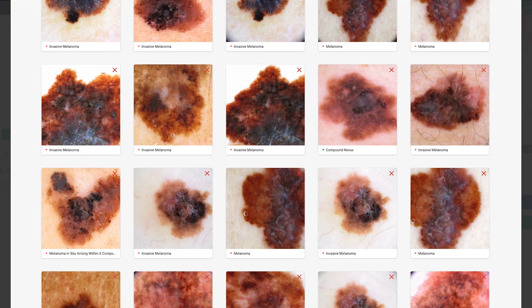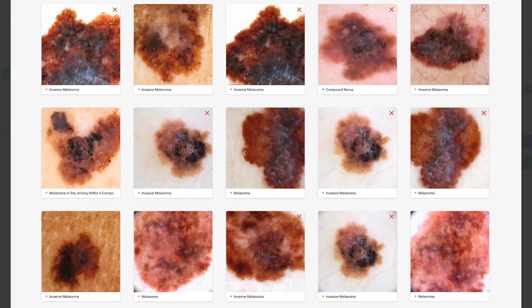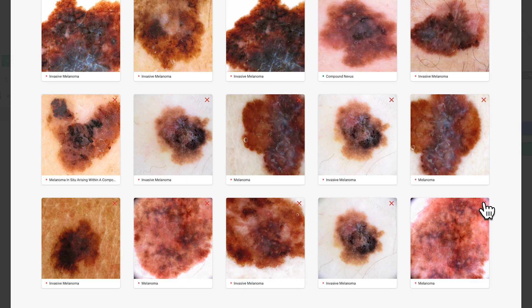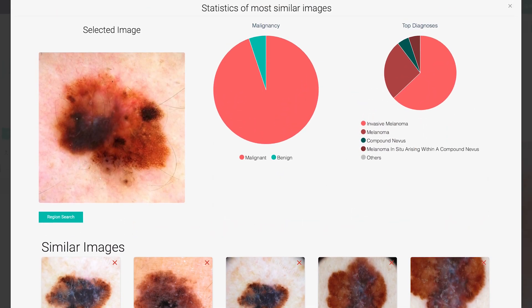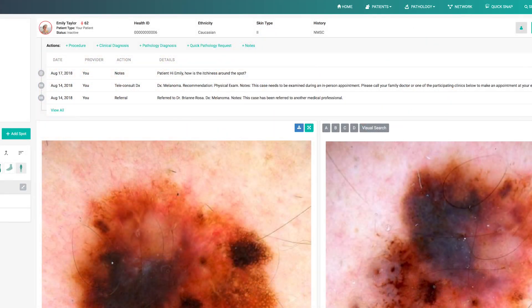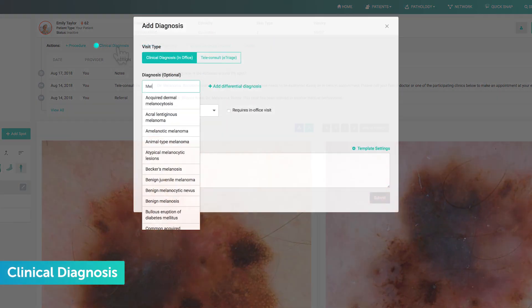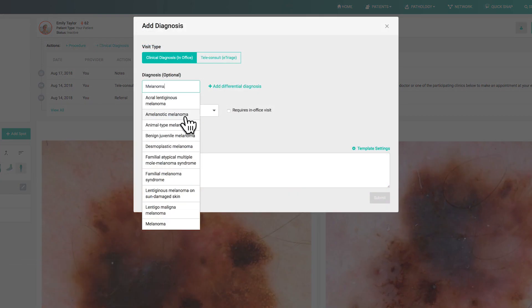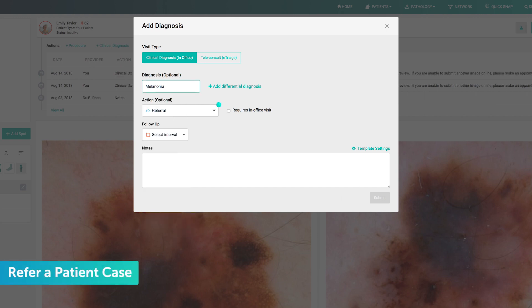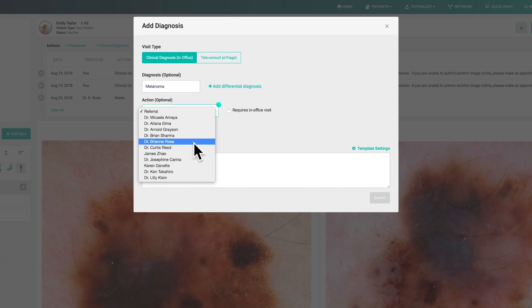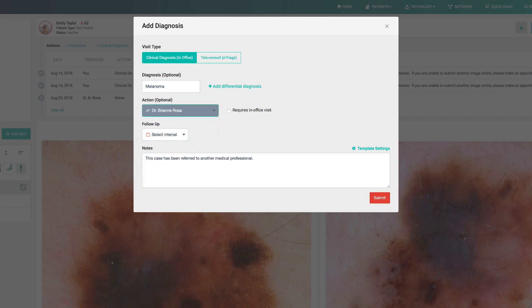based on statistics of similar images — it is not a malignancy probability of the query image. If you see a listed image that doesn't appear similar to your case, you have the option of removing it from the list to help improve the accuracy of the provided statistics. Now that we've analyzed this patient's spot, it's time to document it by adding a clinical diagnosis. Click the Clinical Diagnosis button in the action bar along the top. A pop-up will appear allowing you to fill in your diagnosis with a wide variety of options. Next, you have the option of referring the case to a colleague in your DermEngine network with the purpose of receiving a diagnosis. This is useful for when you wish to receive a second opinion on a case. If you'd like, you also have the option of setting a follow-up interval.